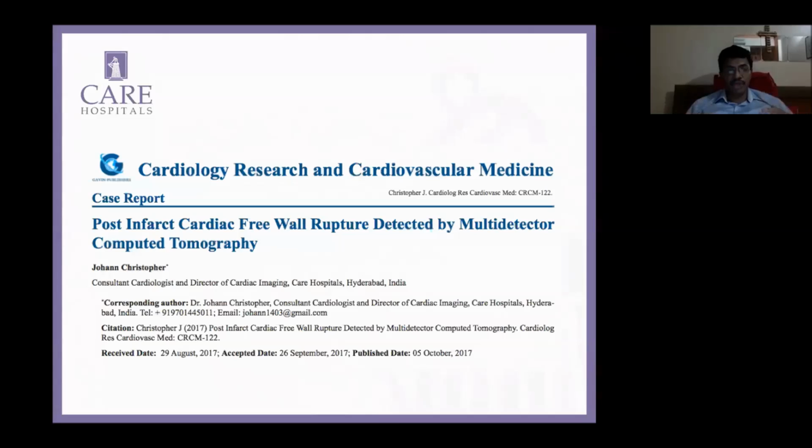Because without the coronary anatomy, no surgeon is going to touch this patient. So I have completely stopped doing MR for these patients. And day one, or at ground zero in the ER, I get a call: there's an acute MI, thrombolized or late presentation, chest pain ongoing, more than moderate pericardial effusion. We are just doing CT for these patients.